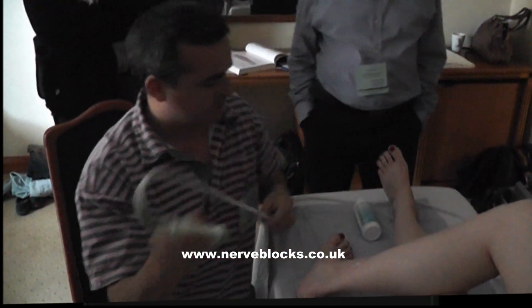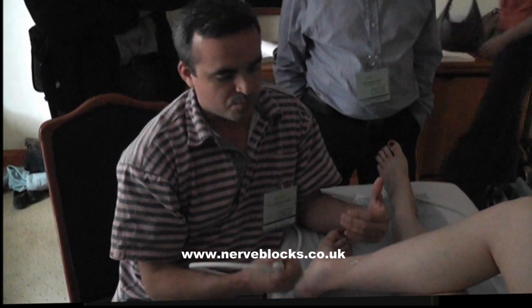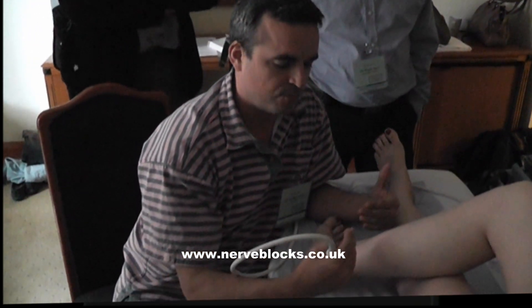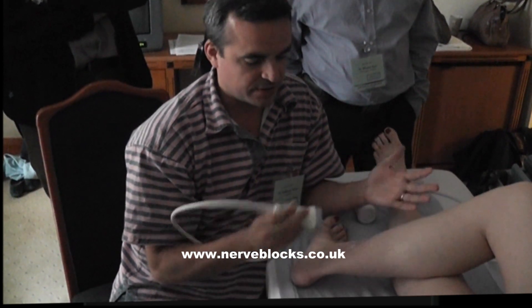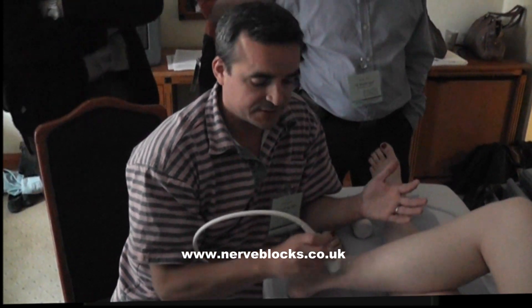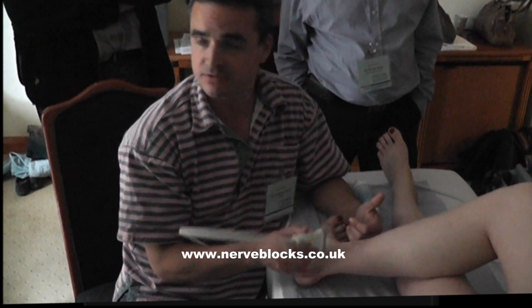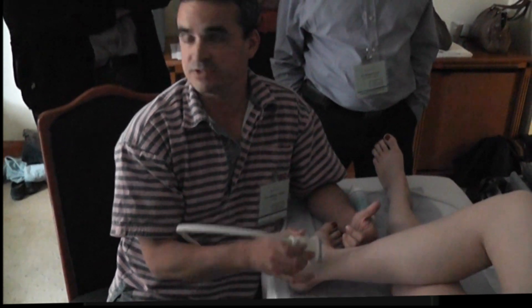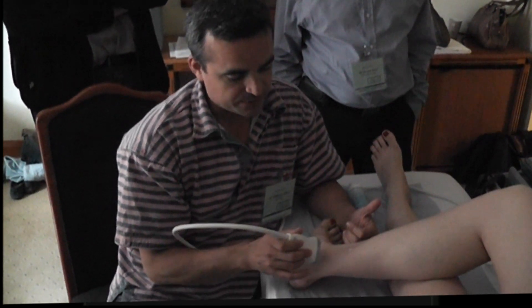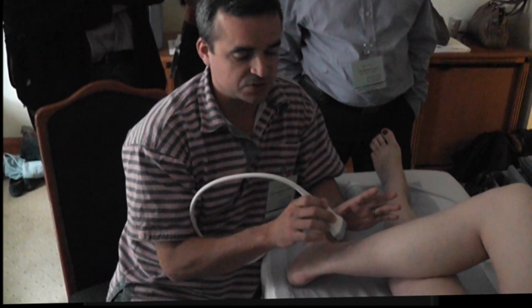So to start with, it's a little bit of a misnomer to call this an ankle block, because most of the injections that we're doing are actually substantially more proximal to the ankle than the classic technique. And there are a couple of reasons for this. The main ones are that around the bony prominences of the malleoli, it's very difficult to get good skin contact.